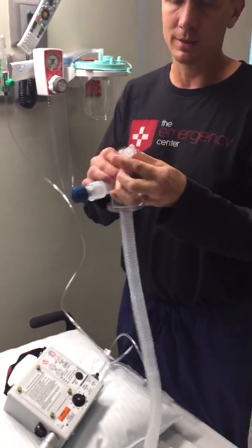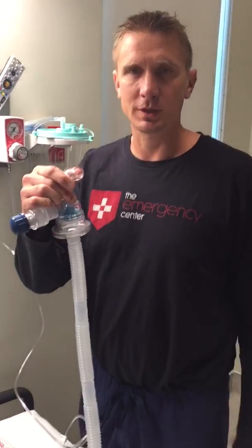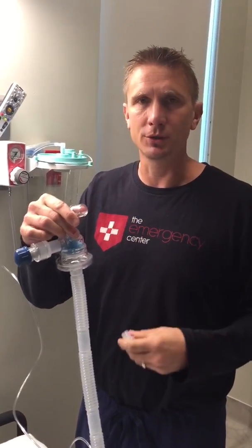Now when you have this piece, it's going to come out right here just like that, and you can hook up your ET tube.